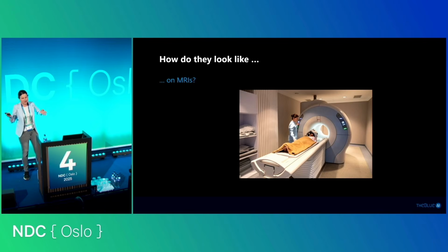This is a series of images that is made by MRI scanners that can look like that or a little bit differently depending on the producer. They create a series of images, like 50, 100, 200 images. It's basically the scanner where you go into, and it makes loud, strange noises. It's not quite well experienced if you are claustrophobic, but it really creates good quality images using magnets and radio frequency. And depending on different settings, they expose slightly different features of our inner organs.